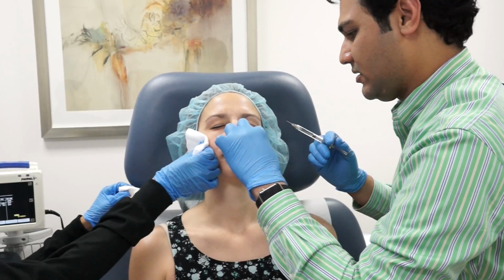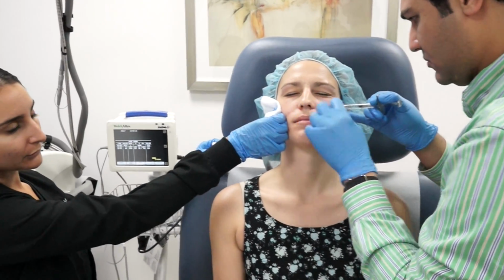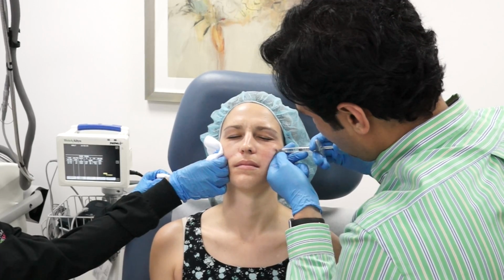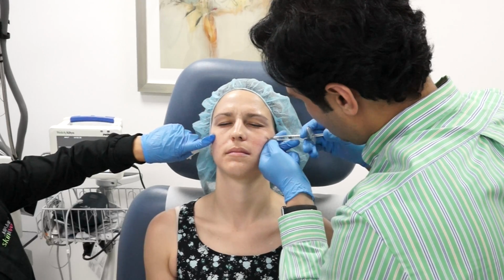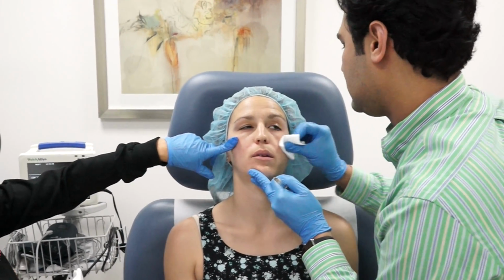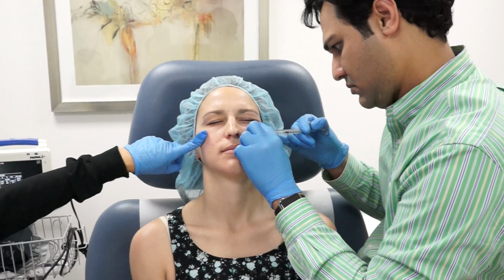Although this is an extremely low-risk procedure, there are certain risks associated with the procedure, infection being one of them, which we minimize by sterilizing the skin, and the second being the risk of injection into a blood vessel, which is minimized by the fact that the injector should be cognizant of the relevant anatomy in the region. I am always palpating the infraorbital foramen, which is the location of the infraorbital nerve and vascular bundle, and I'm also cognizant of the vessels that are tracking along the lateral zygomatic arch and in the temporal fossa.